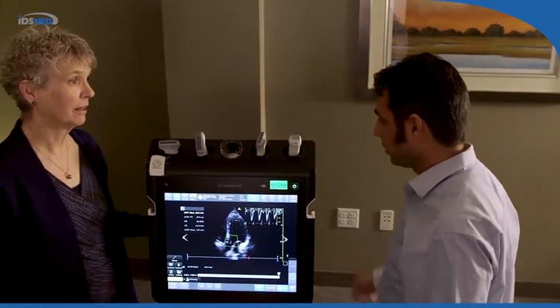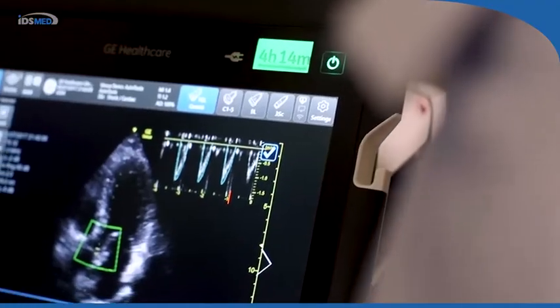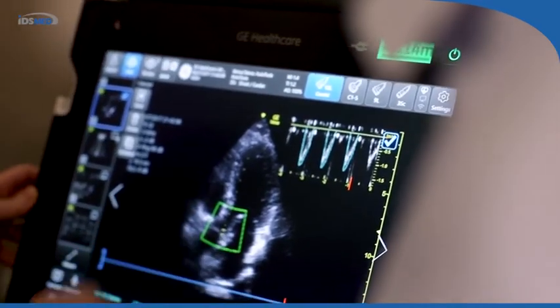We can see that the cardiac output changes, and we can quantify that numerically based upon the interventions that we make. So prior to using the Auto VTI tools, there were a couple of options to assess the cardiac output or cardiac performance and responses to fluid boluses or not. A lot of those involved some calculations that were a little bit time consuming, sometimes complicated, sometimes hard to navigate on kind of traditional ultrasound systems.